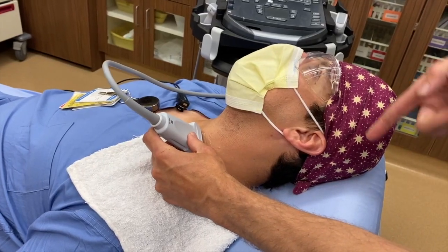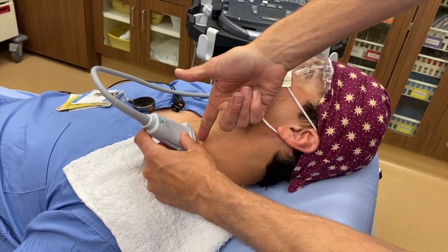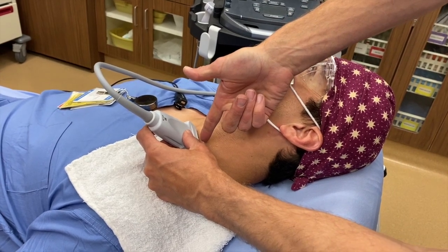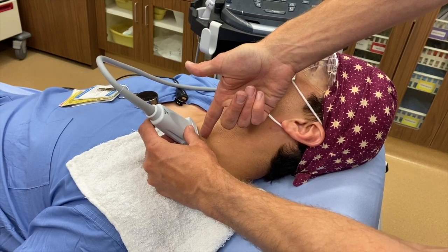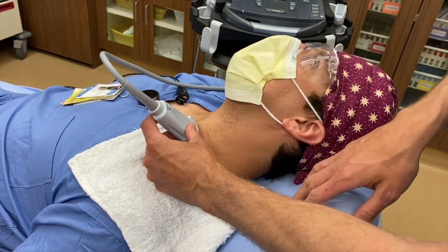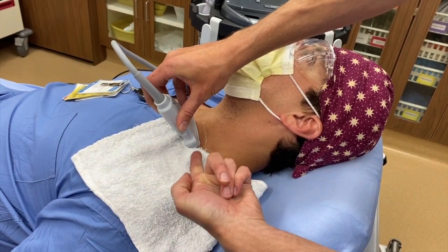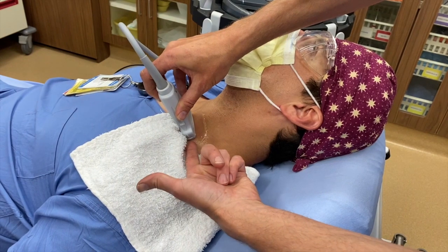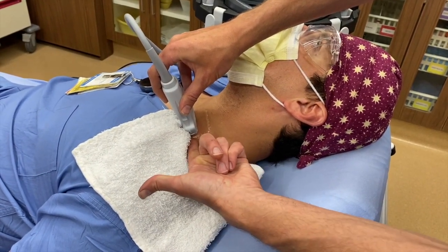The traditional IJ technique is to insert the central line at the base of the transducer towards the ipsilateral nipple. The technique I'm going to show you maintains the same probe position, except you're going to be coming in with your needle in-plane at the base of the subclavian where it inserts into the IJ and goes down to the heart — so your needle trajectory will be here.